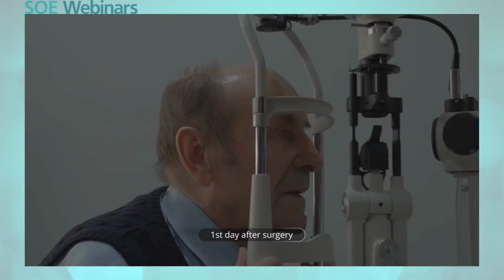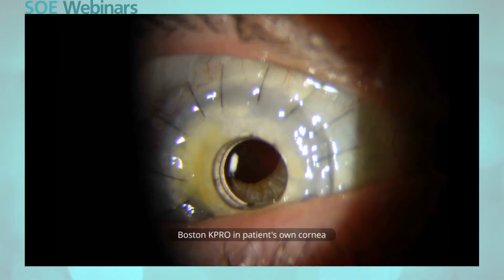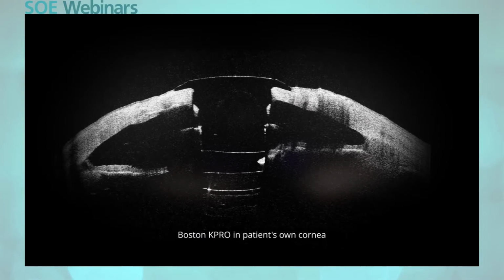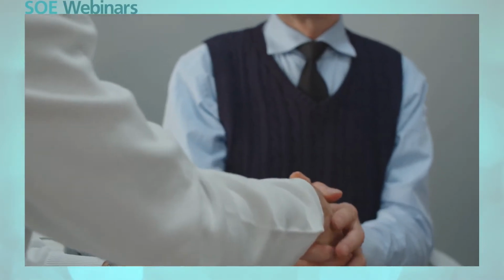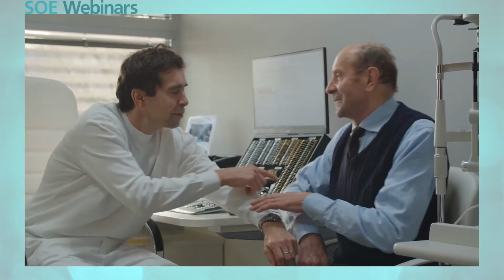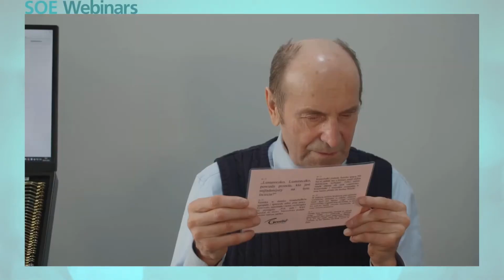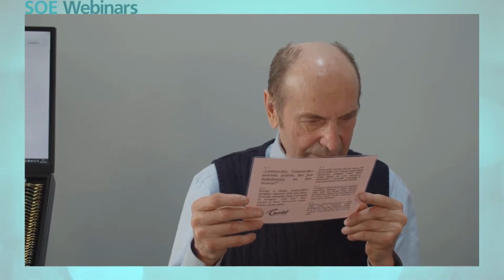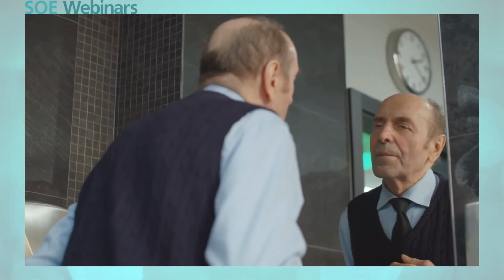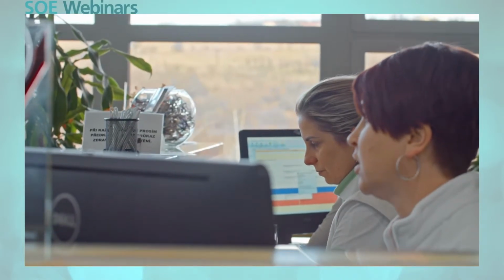The first day after the operation, after the eye was uncovered, the patient could see after 16 years of blindness. Visual acuity was 0.5 uncorrected, and the patient rejoiced that he could recognize different colors of shirt sleeves and even read without glasses. He also looked at his face after 16 years. He and his family were exceedingly grateful. His son says they were surprised he could see so well after such a long time.